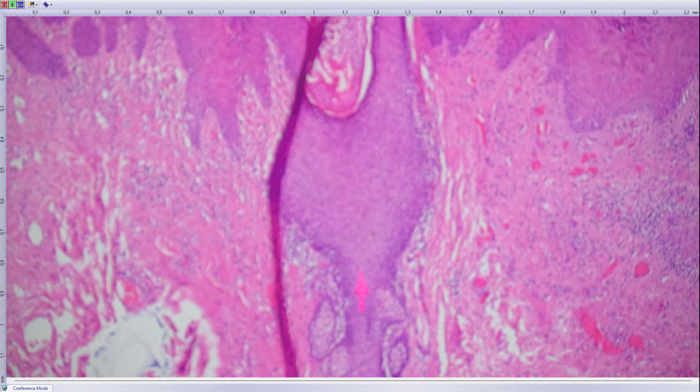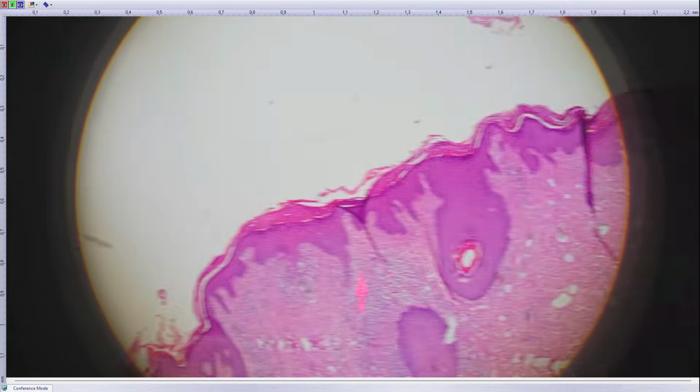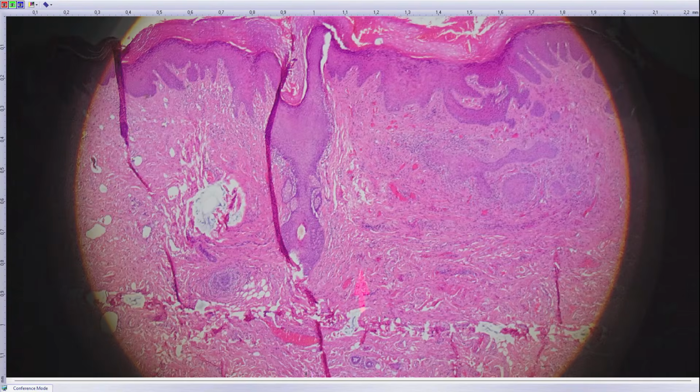Yeah, here I have a large excision of a perianal lesion. I once showed you a probatory excision of it. It's an excision from the perianal area of a male.